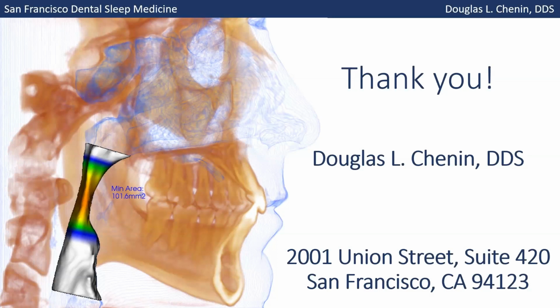What I try to do, even without that imaging modality or functional assessment capability, is within the cone beam and in my clinical assessments just try to assess their nasal breathing. And usually there's something that's subpar. The valves kind of pinch in, or there's resistance, or there's a deviated septum, or there's a tendency to mouth breathe.